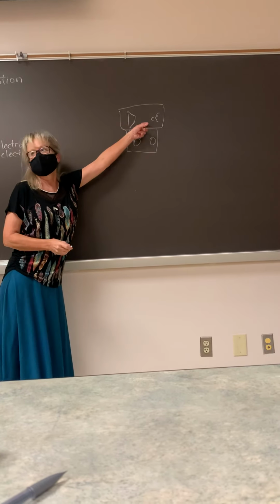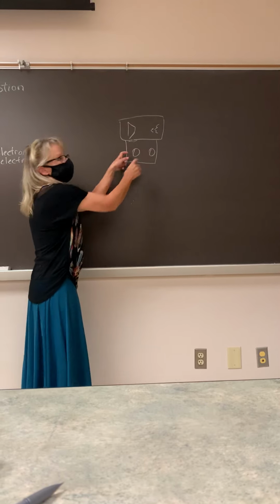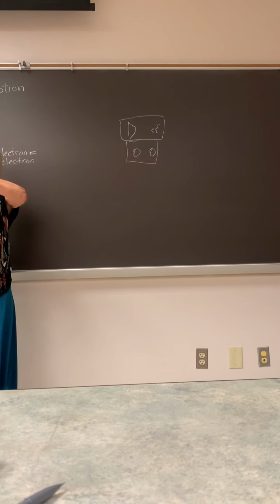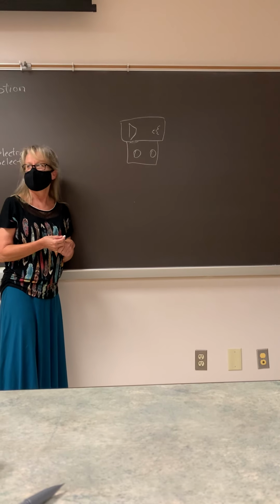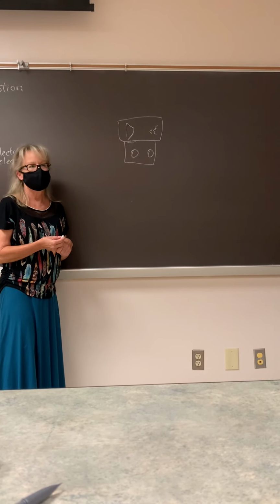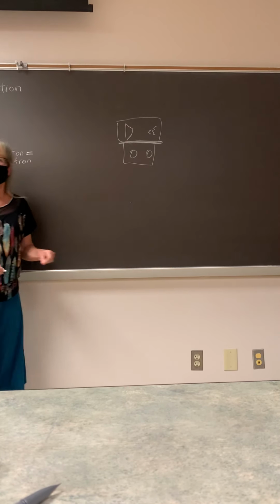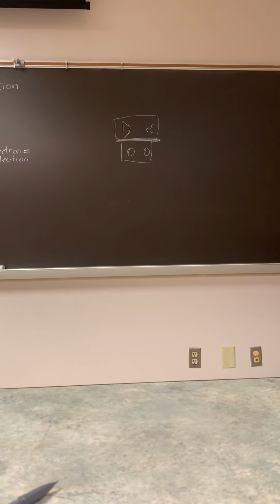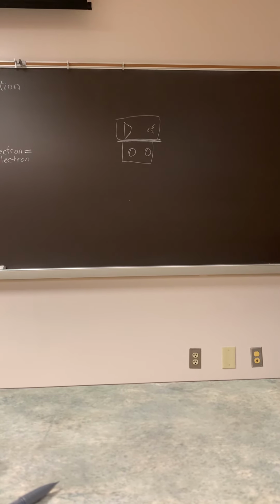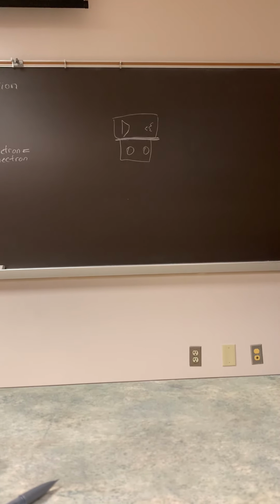The tube is actually up here, right? And then there's a little window and the X-ray photons come down. That's your collimator, right? Where's the added filtration? Not on the outside of it. The added filtration is between the tube and the collimator. Don't forget that. That's registry stuff.